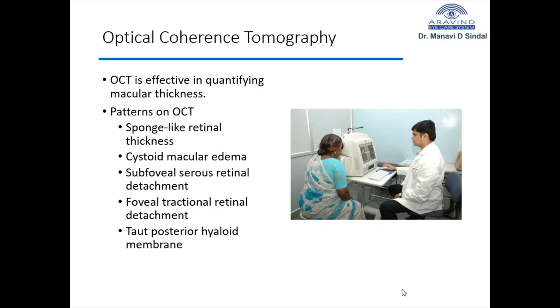Optical coherence tomography or OCT is a very widely used investigative modality by us today. It not only helps us to classify and determine the various features of diabetic macular edema, but also to monitor progress of treatment. These pictures which I am showing here of the OCT and you saw of the fundus camera before are older pictures which I have been using in my presentations for long and continue using for kind of a sentimental value, because they show some of my very close colleagues whom I worked with.